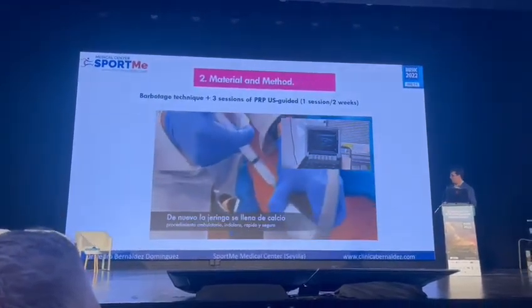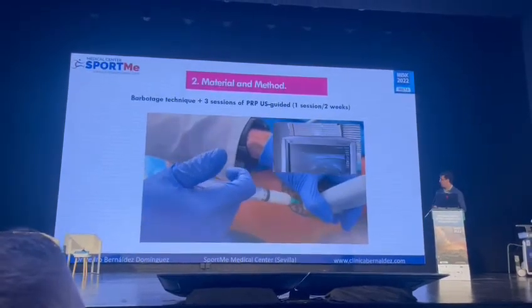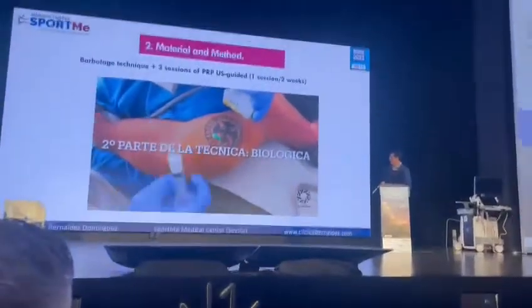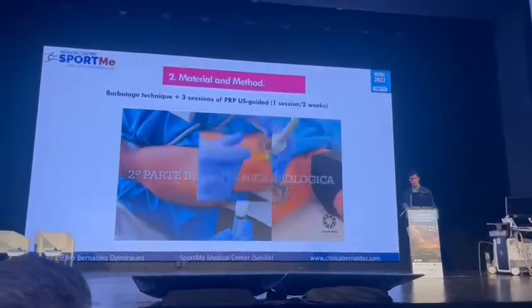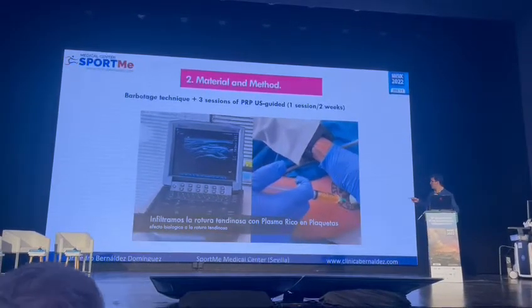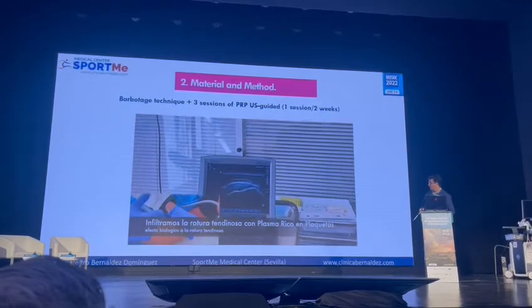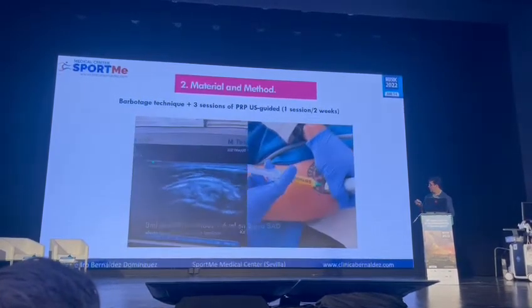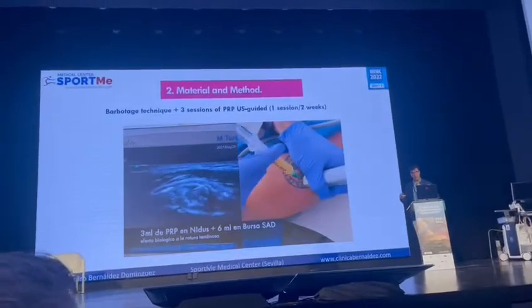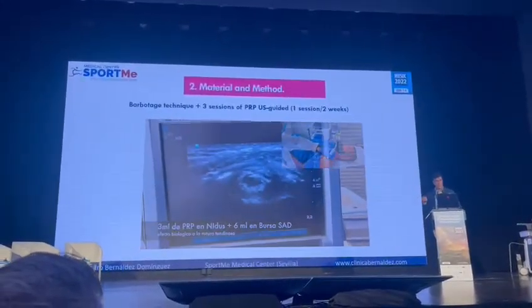And then, when we finish with 2 or 3 syringes, depending on the case, we fill all the tears with PRP, 3 milliliters inside of the lesion. We call it the nidus of the lesion. You see it very clearly, nidus. And then we put 6 milliliters of PRP in the bursa. We repeat the procedure 2 weeks later, only with PRP in the bursa, and 4 weeks later, the first session.